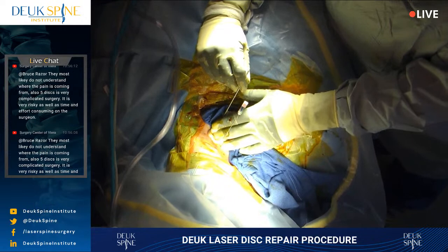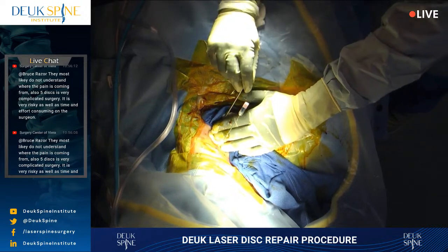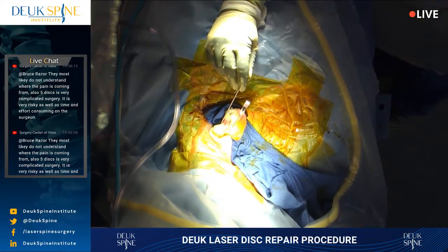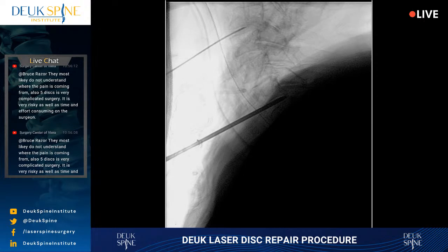So we have done the C6-7, back up please, disc repair, and now we have a C5-6 to do next. Our patient is still asleep. We've made 1 incision. It's 4 millimeters. We fixed C6-7, and now we're going to go in and fix the C5-6 disc. Shot. Is that it right there? All right, good. Actually, it's pretty good view of 6-7, right? All right. Now I need you to get 5-6 beautiful for me, okay?